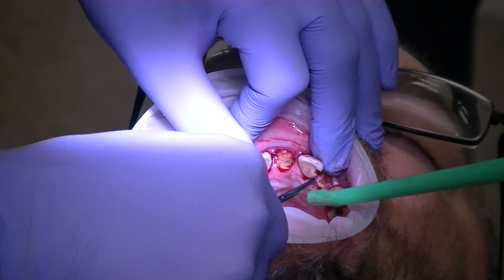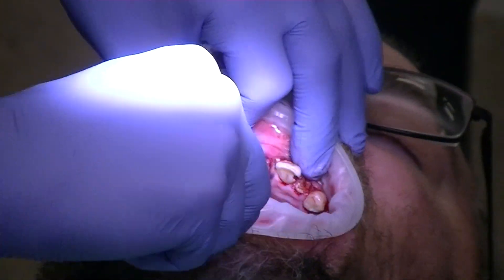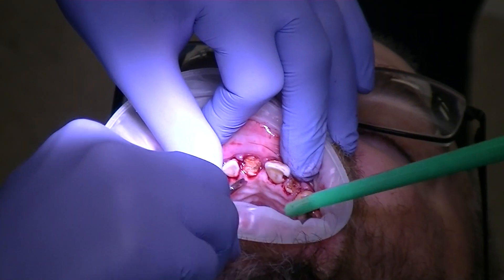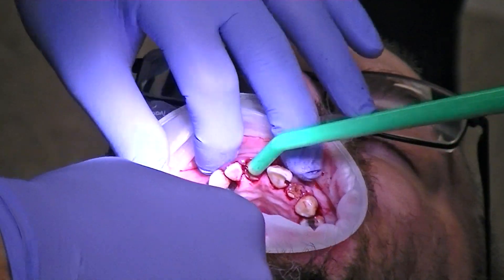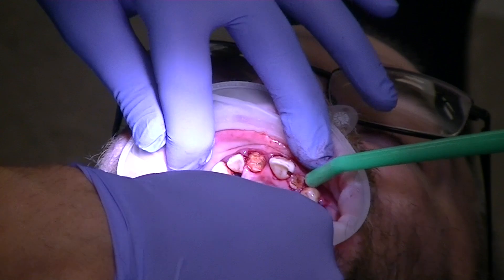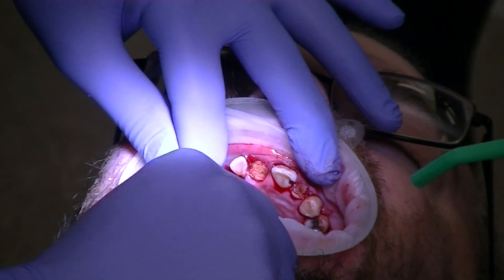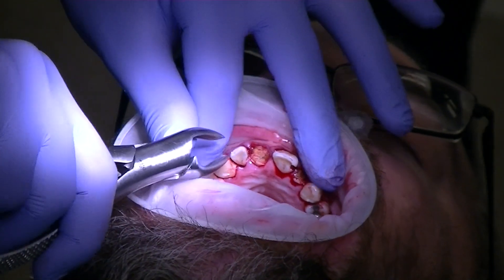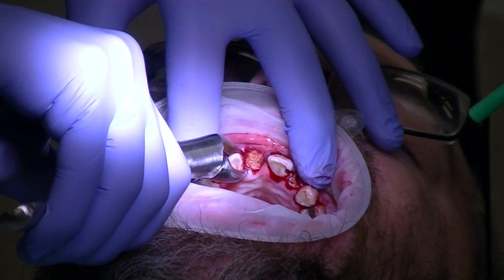Everybody see the force I'm using? Severing the PDL and then just trying to get some movement. If you take a look at number seven, I already see movement on it — just me turning it. If that's happening just like that, I don't even have to go to the physics forcep; I can go straight to this.